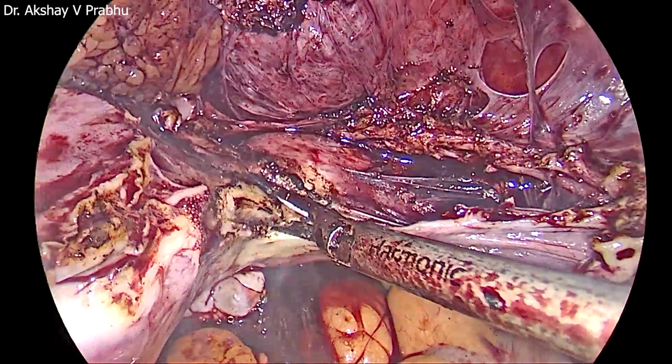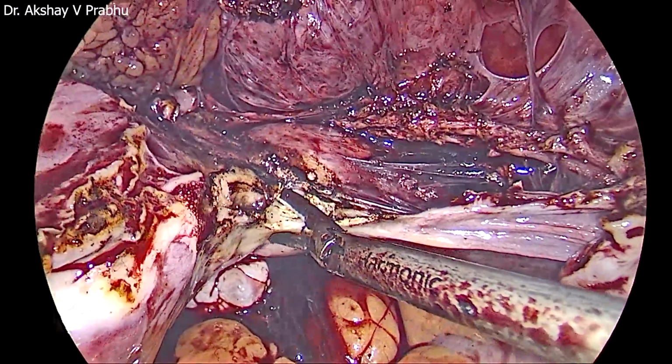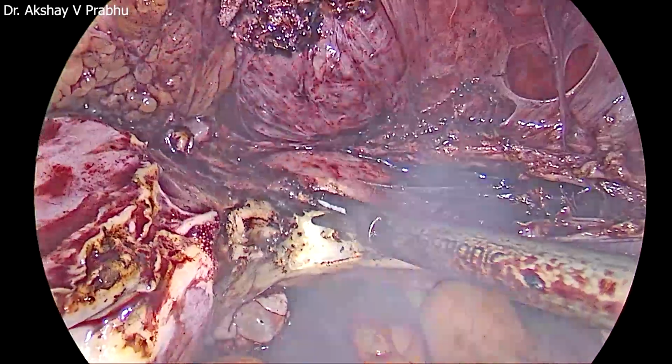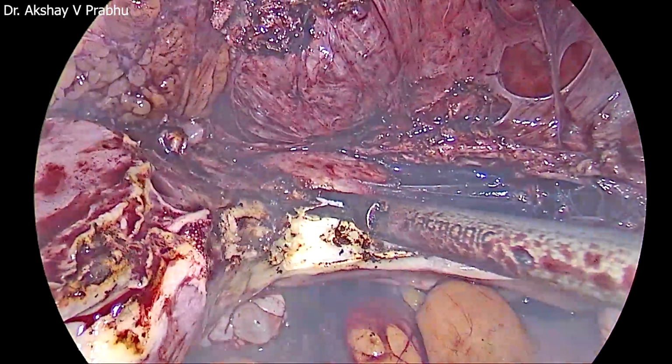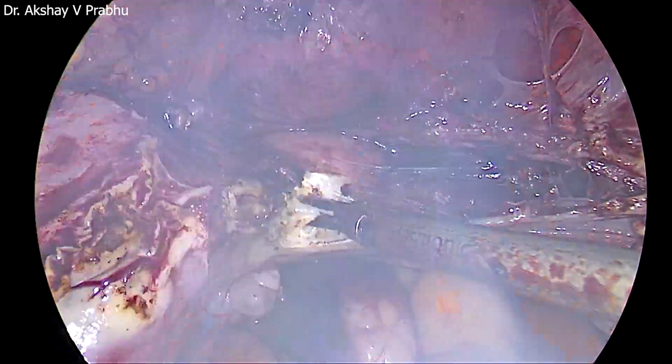Now we come to a basic normal hysterectomy because now the planes are clear. There's nothing. Now moving more to the uterosacral side. Uterine is taken in that bunch. We are taking the uterosacral cardinal ligament complex. Soon we'll be operating on the vault and opening it up.